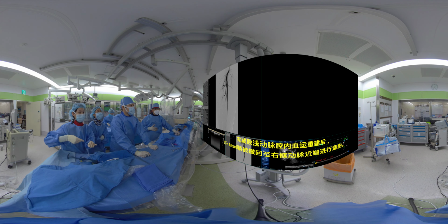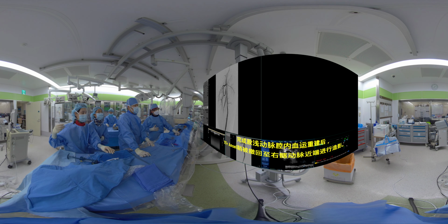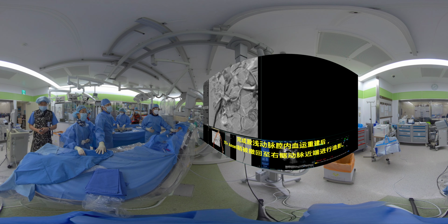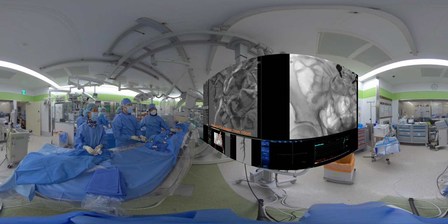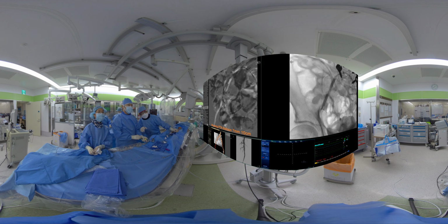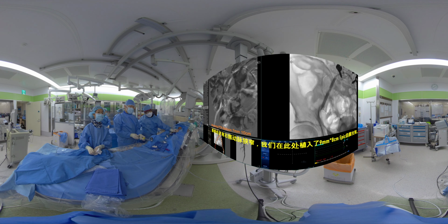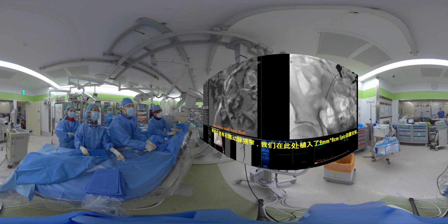After completion of SFA revascularization, the 7 French sheath was withdrawn to the proximal right iliac artery, and then an angiogram was performed. There was a tandem stenotic lesion which was stented with an EPIC 9 millimeter, 8 centimeter self-expanding stent.